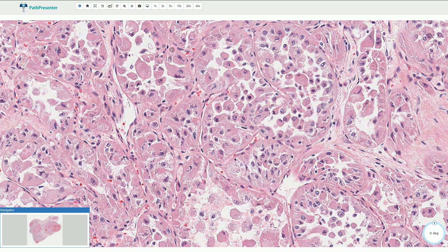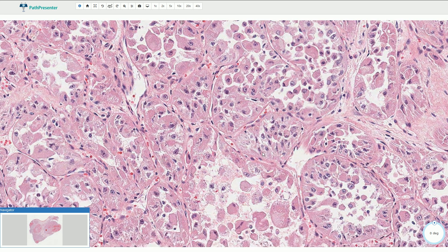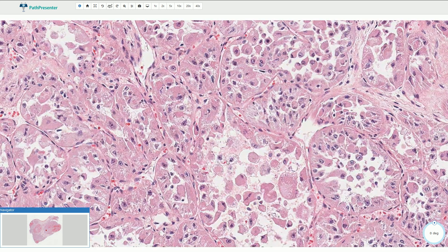The nuclei are typically round to oval shaped with vesicular or clear chromatin and typically one centrally located prominent nucleolus. If you pay closer attention, you can find one single central nucleolus in all of these lesional cells. The cytoplasm can sometimes be clear or vacuolated, but it is usually eosinophilic and granular.